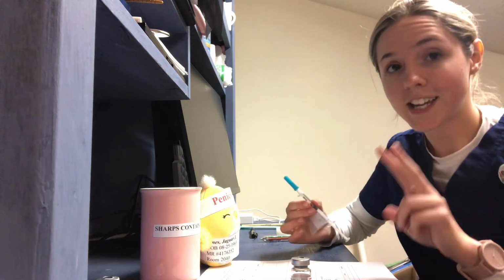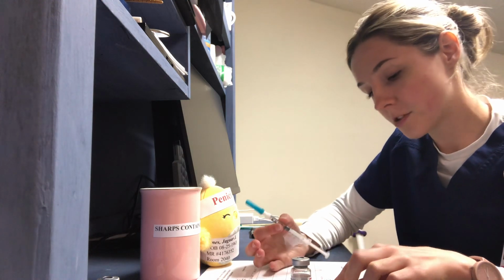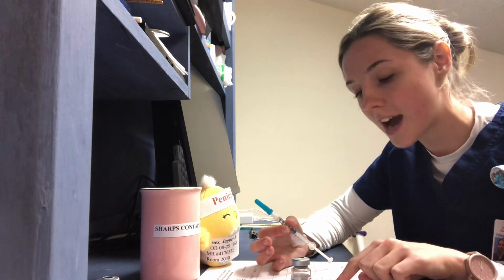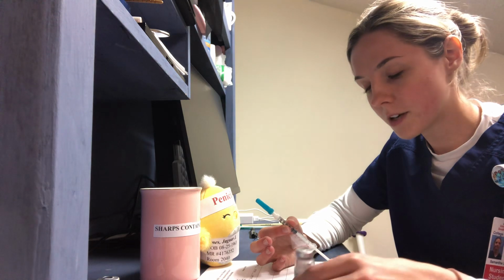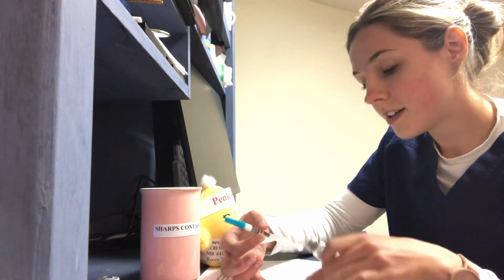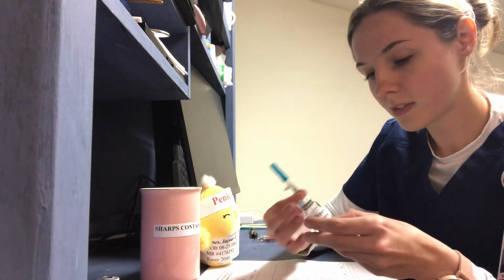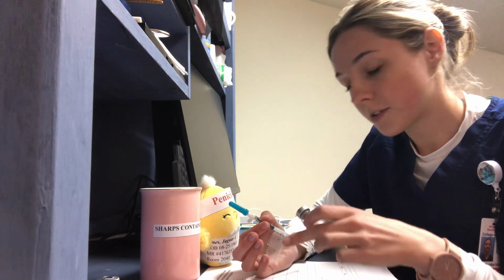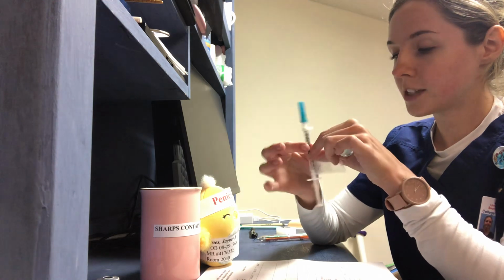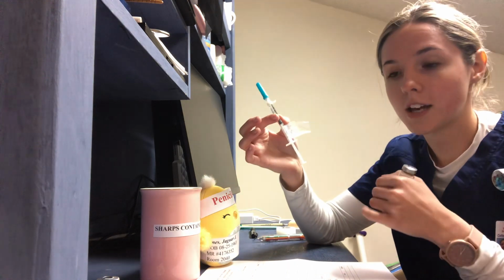We're going to perform our second check of the 7 rights. So first we're going to start with making sure you have the right patient, Jaguar Jones, medical record number 417-6352, date of birth 8/25/1963. We're going to make sure we have the right medication, heparin. We see it in the MAR, heparin. I have the vial here, heparin, and I have my medication syringe, heparin. We want 5,000 units for the right dose. We have 10,000 units per milliliter in this vial, so we need 1/2 milliliter. We're going to double check that we actually have 1/2 milliliter in this syringe, and we'll actually have a second nurse double check if that is necessary.